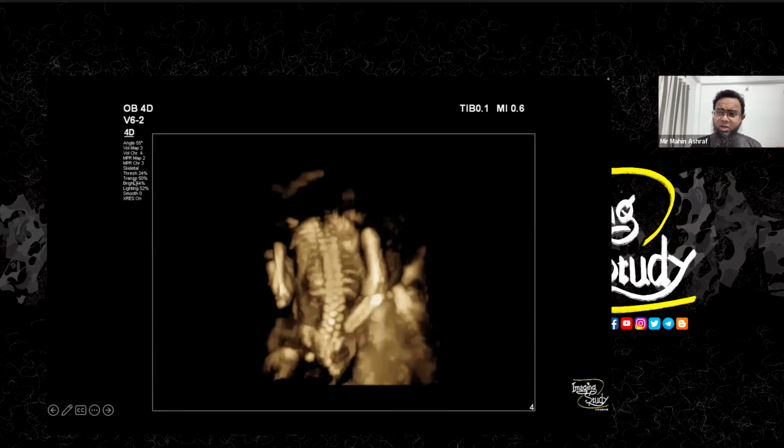We have the skeleton mode. It may be shown as skeleton, skeletal, X-ray, or bone mode. So here we can see the fetal skeleton, and you can detect skeletal abnormality, especially spine abnormality, with this skeleton mode. It can also be used to detect a calculus within the gallbladder or any other part. So the main principle is that only the very highly echogenic areas are shown in the image, and the rest gets deleted. So that is the principle. Bones are very bright, so we are trying to see the bones.